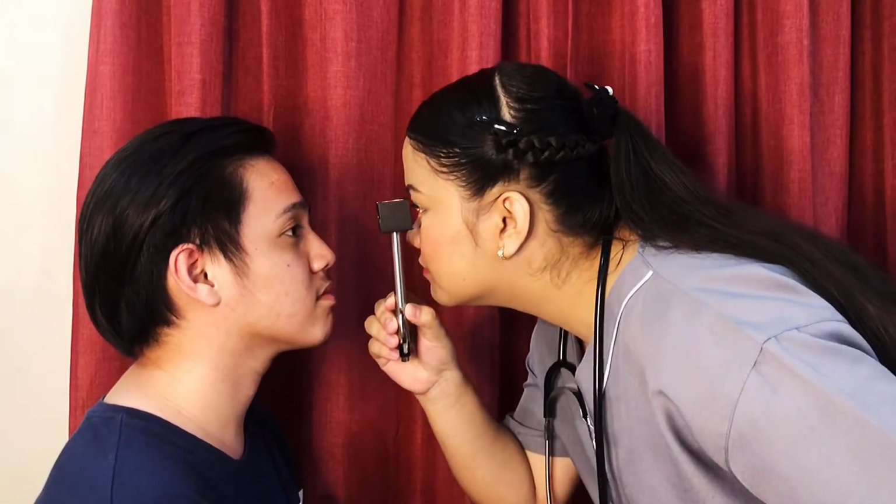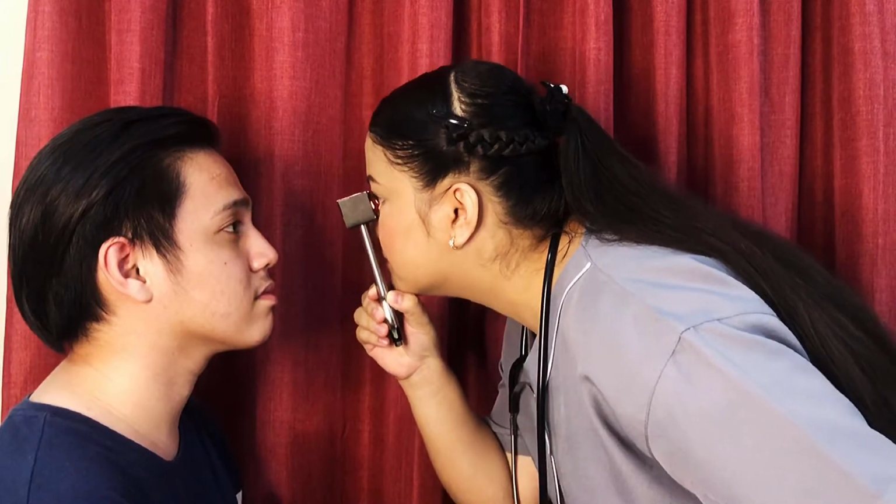And now, sir, let me check the red reflex in your eyes using this ophthalmoscope. Based on my observation, sir, a red reflex is emanated from both of your eyes, and they are both symmetric in character, and it is considered normal.